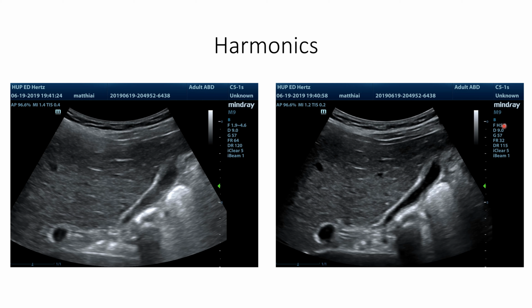But that's why it just says 5.0, because it's only listening to that second harmonic, and that's why the H is on, and that's why the image looks nice. So if you want to take a step back and look at the big picture, you would say no harmonics, bad image; harmonics, awesome image; harmonics equals awesome.